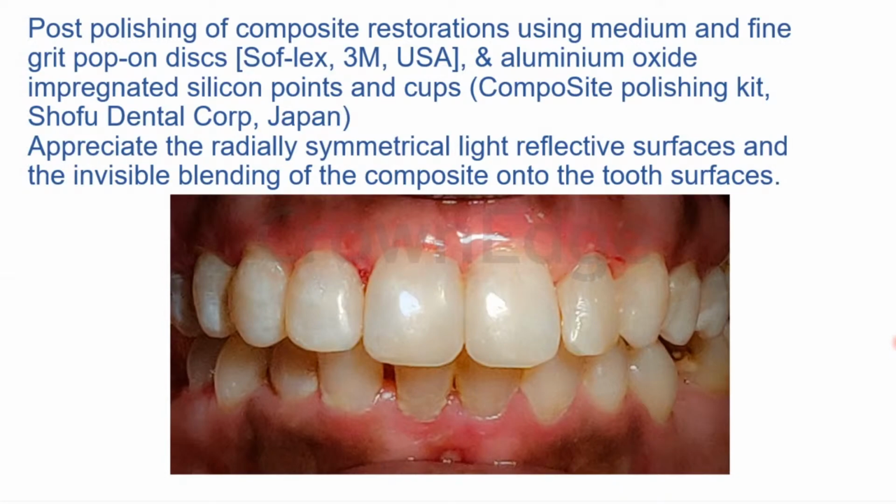We were also discussing whether we should go ahead and change this incisal angle to a more sharper incisal angle to mimic this. So a little bit of this polishing over here also would have helped. Apart from that, a decently restored anterior case.